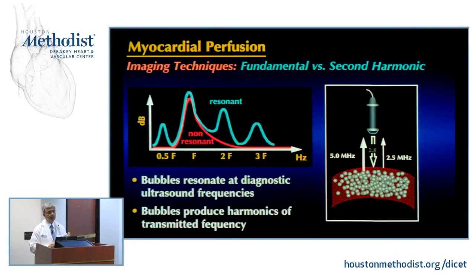The other area of contrast, so we talked about mechanical index, right? We talked about attenuation. We talked about the importance of mechanical index to preserve these. The second, I think, most important principle if you are doing contrast is the concept of harmonics. And this is fundamental. Let's say a transducer is emitting at 2.5 megahertz frequency. When it hits different structures, if you will, it may emit resonant frequencies, which are multiples.